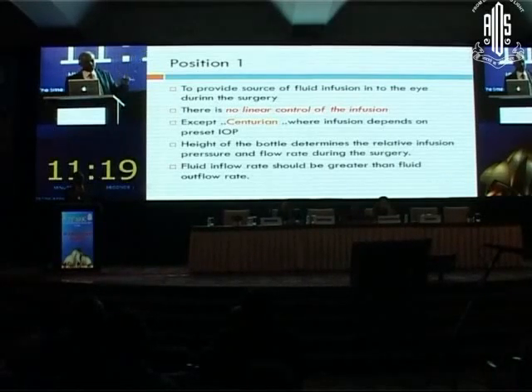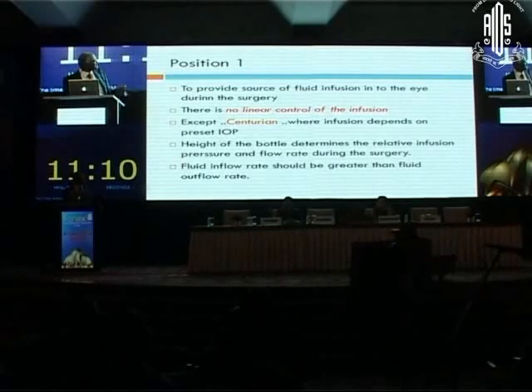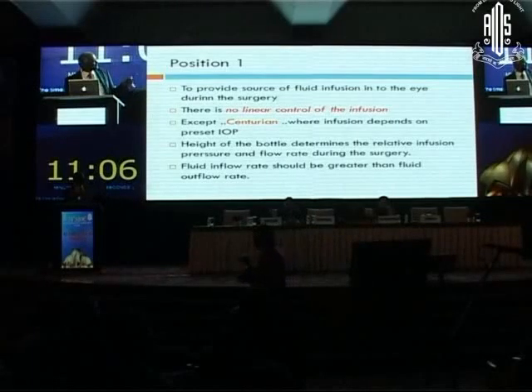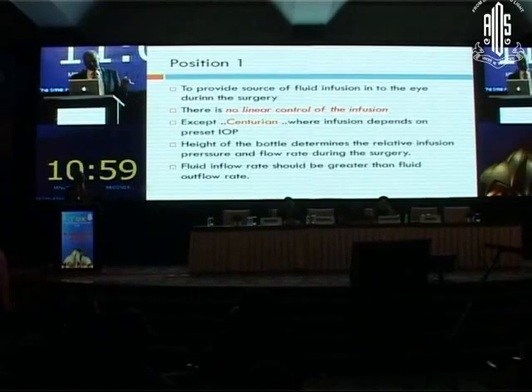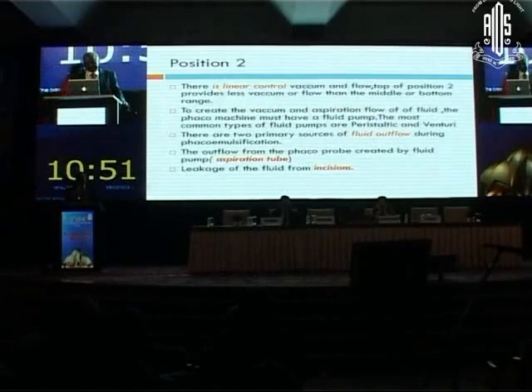Whatever intraocular pressure you want to maintain can be maintained by the infusion in the Centurion machine, and the height of the bottle in the normal case determines the relative infusion pressure and the flow rate during the surgery. The fluid inflow rate should be greater than the outflow, so that the anterior chamber will remain filled.